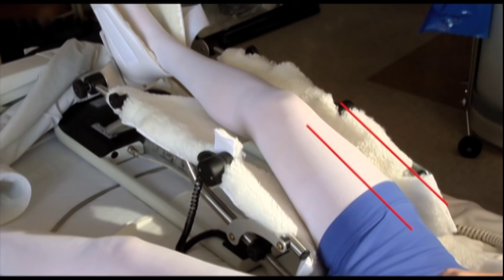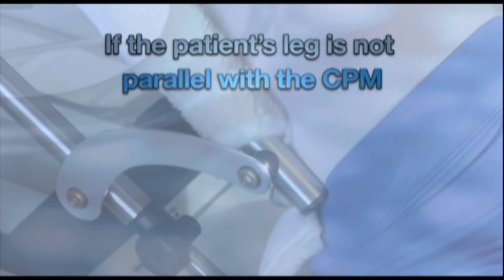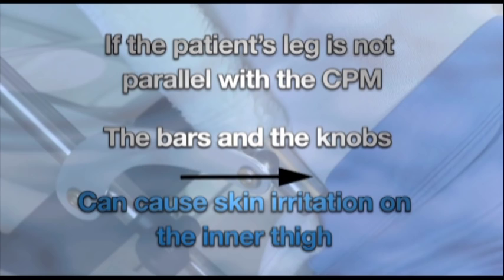Once you have abducted the leg, you will want to verify that the patient's leg is parallel with the medial and lateral bars of the CPM. If the patient's leg is not parallel with the CPM, the bars and sometimes the knobs on the CPM can cause skin irritation on the inner thigh as illustrated in this video.